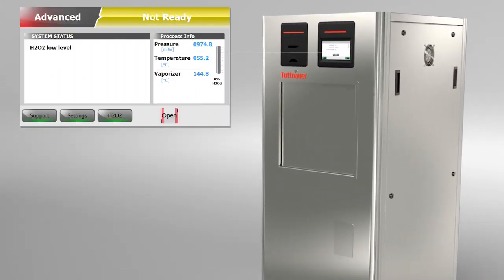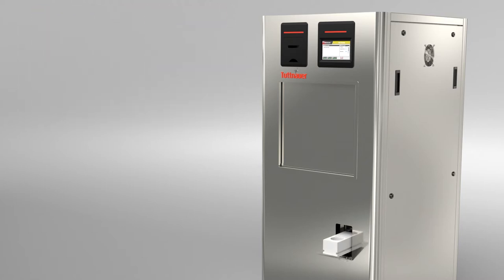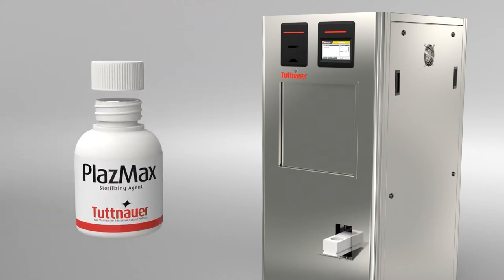The control panel indicates the level of the sterilizing agent and allows opening the loading drawer. Remove the agent tap and place it in its drawer.